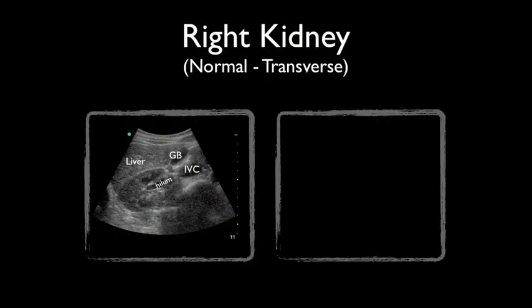The transverse view of the kidney appears C-shaped. The bright area around the kidney is Gerota's fascia and perinephric fat. These are normal findings.